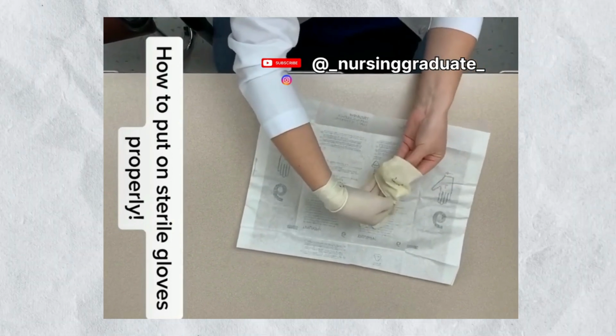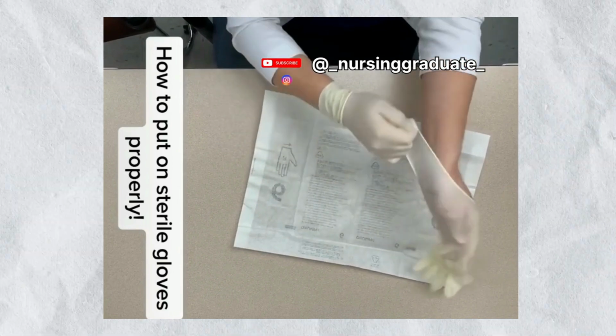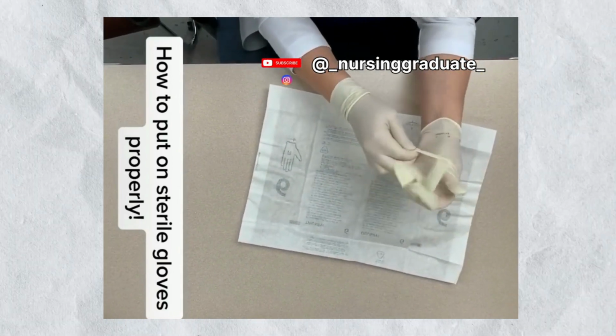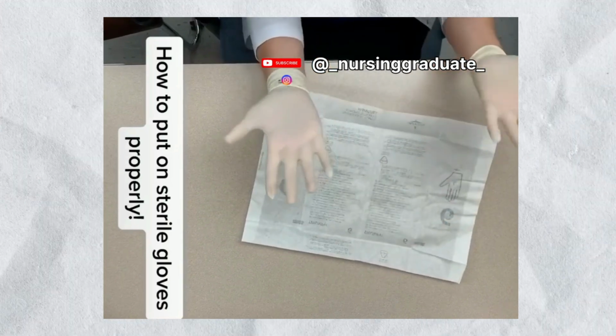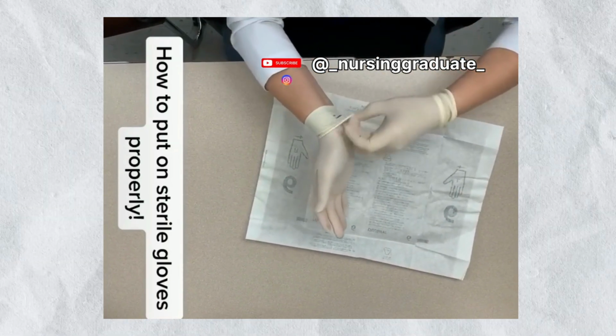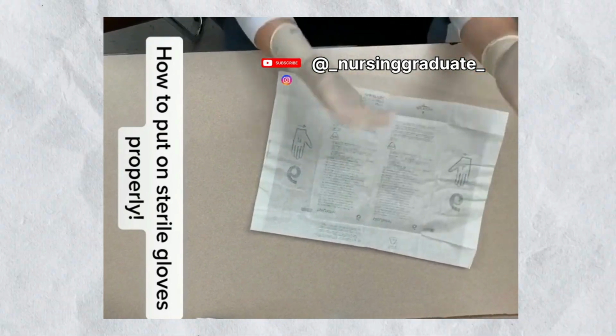So go on like this, keep your hands like that, and then you're just gonna flip, and you're gonna struggle, so it's okay. And you can just like that, right? Now, this is the outside, so you don't wanna touch the outside, so you just go like that. Okay, same thing. You wanna pull it like this.